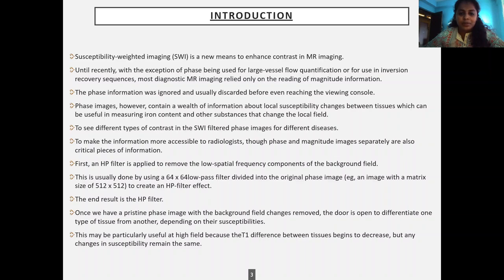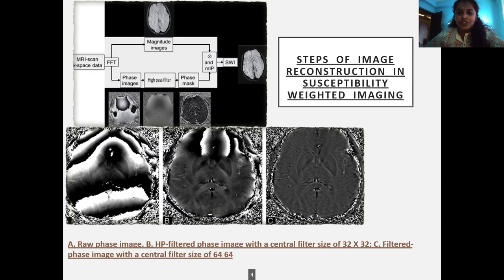Once we have a pristine phase image with the background field changes removed, the door is open to differentiate one type of tissue from another depending on their susceptibilities. This may be particularly useful at high field because T1 differences between tissues begin to decrease, but any changes in susceptibility remain the same. The steps of reconstruction in SWI begin with a raw phase image, then an HP filtered phase image with a central filter size of 32×32, and next a filtered phase image with a central filter size of 64×64.